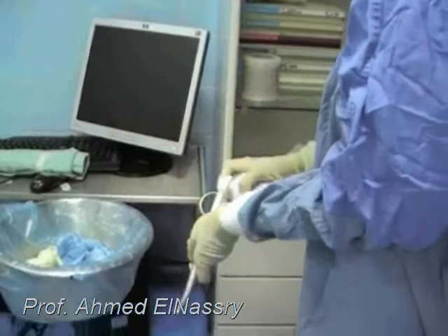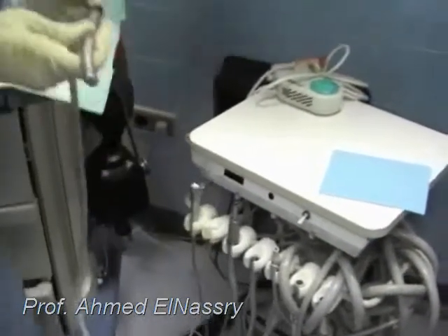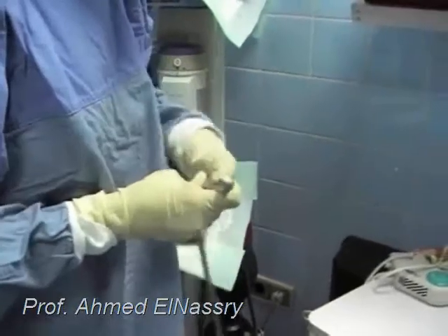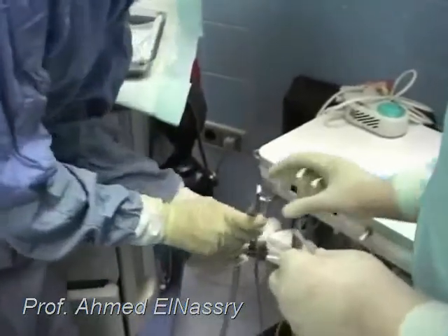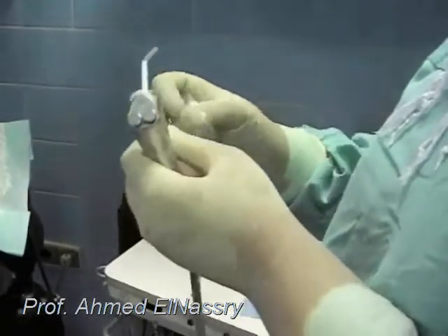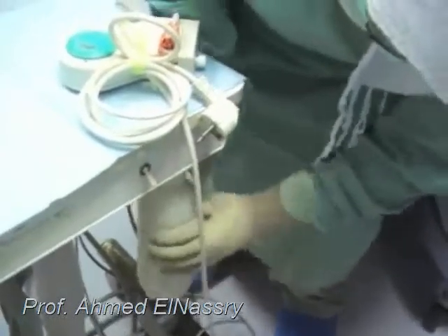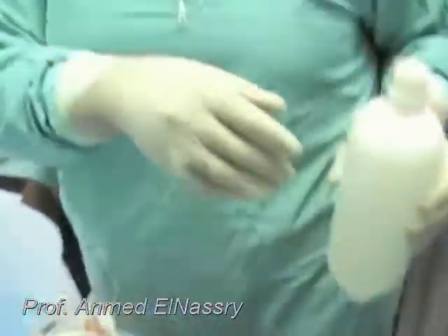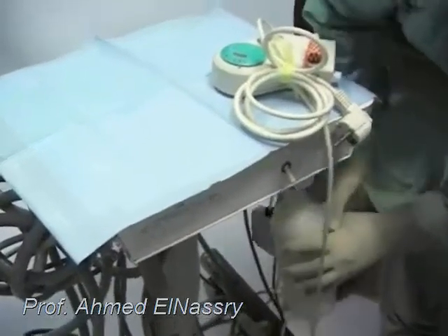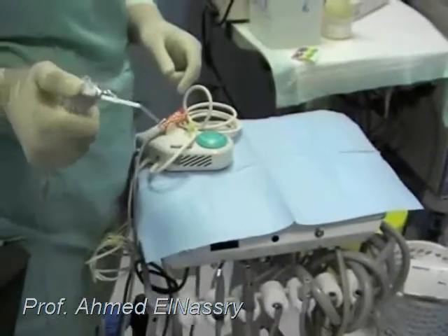Preparing the handpiece by holding it and connecting it to the machine. Preparing the two-way syringe and covering it with a protective barrier. Filling the feeding water bottle with distilled water, and double-checking every part — including a double check of the two-way syringe.